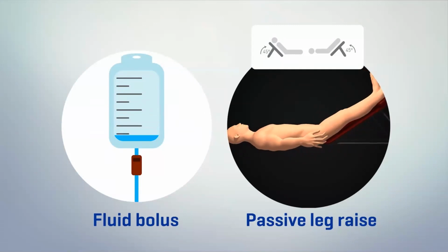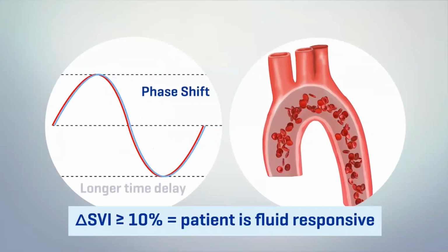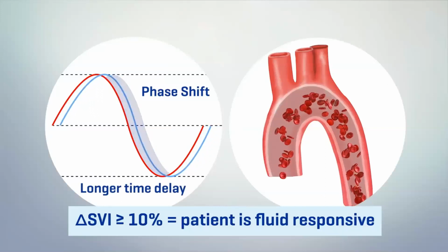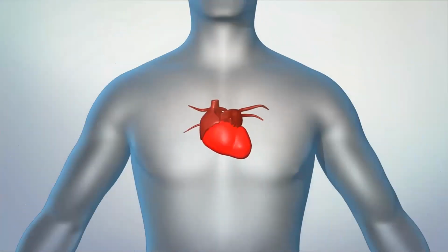So we give a fluid bolus with this passive leg raise test, and we see if there's a change. And see, there's that 10%, and you say, yep, they're ready, they need more fluid. Because there's no reason to give fluid to a patient who does not need it.